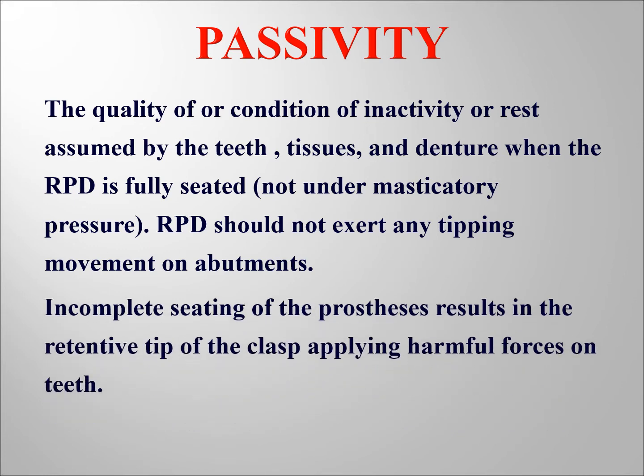All right, now incomplete seating of the prosthesis results in the retentive tip of the clasp applying harmful forces on the teeth. This is very common, so that's why when completely seated, it should exert no force, because if it is incompletely seated, then it will be exerting continuous forces on the teeth. This is why you have to make sure that the fit of the prosthesis is perfect.